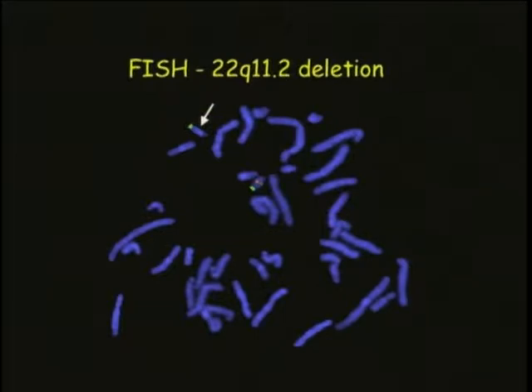So now the standard of care is to diagnose this deletion using FISH. So this is the normal 22 here with the orange probe in the critical region for the deletion, and the green probe is a control probe. And this is the deleted chromosome 22 here. And you can see the absence of the orange signal that indicates the deletion.